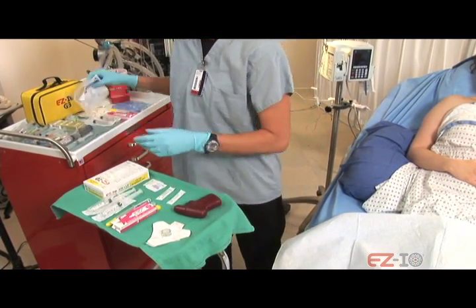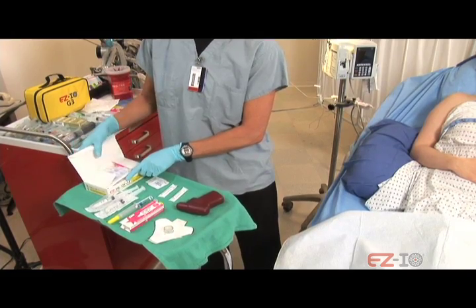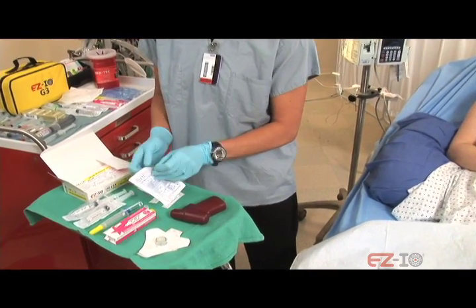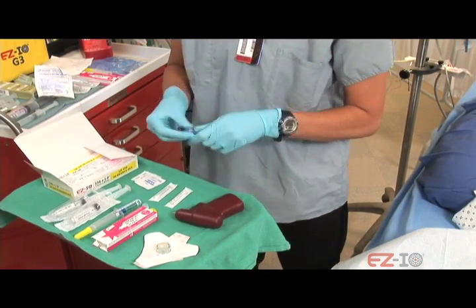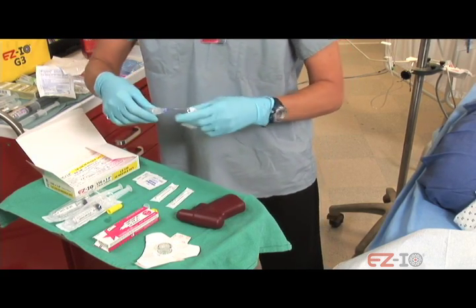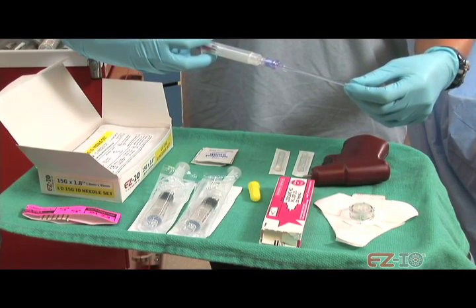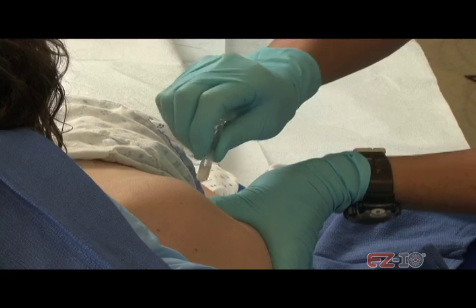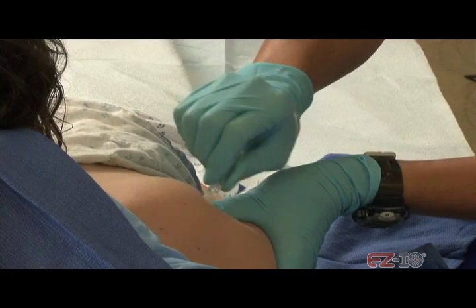When you're ready to place the needle, remove the Easy IO driver from the case and remove the trigger guard if present. Select the appropriate needle set and inspect the packaging for damage. Prepare the Easy Connect tubing that comes with the needle set. If the patient is responsive to pain, consider 2% lidocaine without preservatives or epinephrine, also known as cardiac lidocaine, for anesthesia prior to your initial saline flush. Once your Easy Connect is primed, clean the insertion site according to your institutional policy for aseptic procedures.